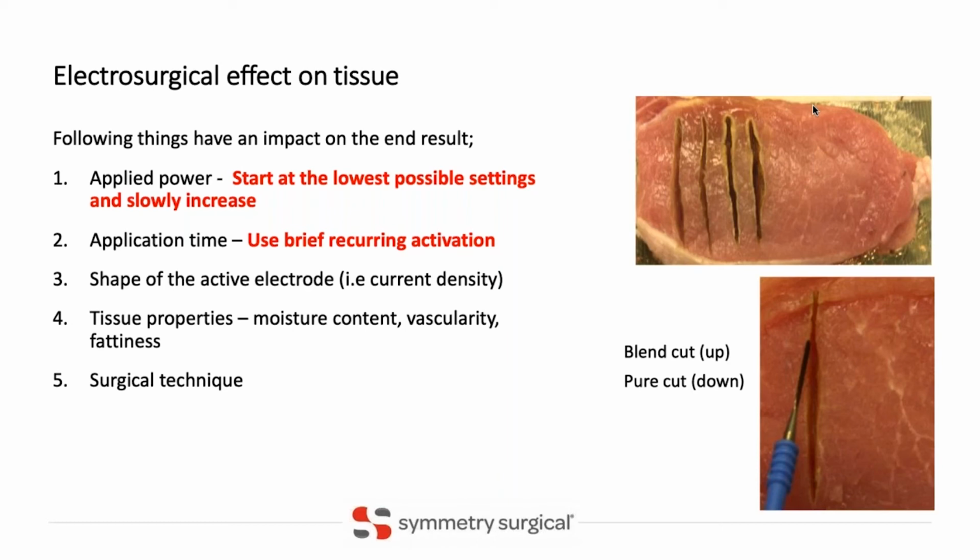Obviously, the shape of the electrode. So we had needle electrodes, blade electrodes, loop, and ball electrodes. The surface area of the electrode itself will have a tremendous effect on how the electricity will be transferred to the tissue.